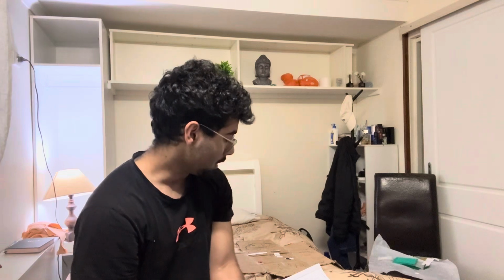So basically what we are doing here is removing the drain tube, and a drain tube looks like a drainage. I don't have an actual drain tube here, but I can tell you how to do it. First of all, the most important thing is you need to have a doctor's order. Once the doctor has said that you need to remove the drain tube of that particular patient, then you are sure that you need to remove the drain tube. Once that's done, you need to do the patient identification.